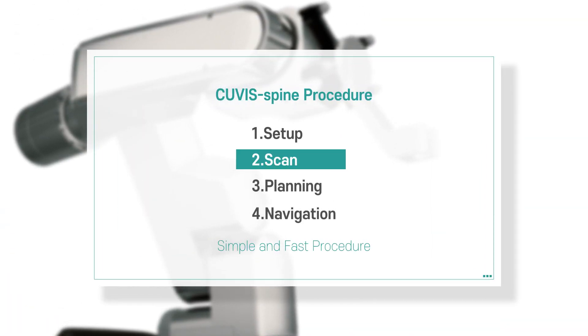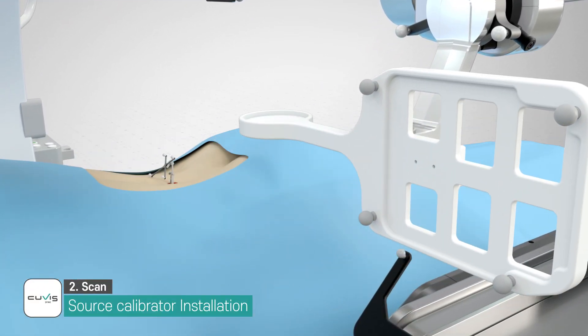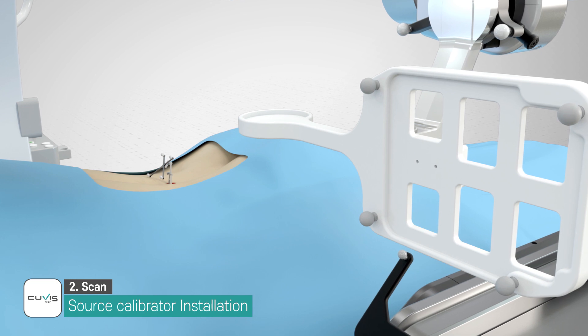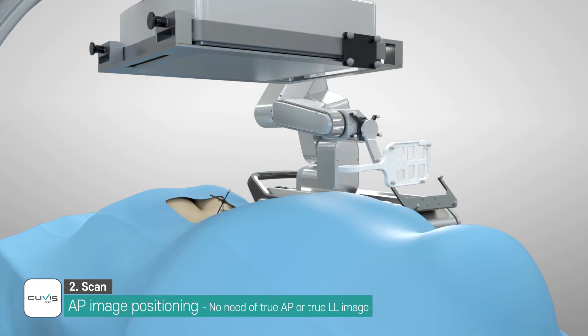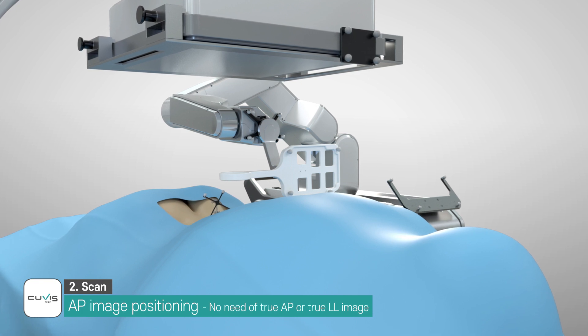Step 2: Scan. The source calibrator is attached to the end effector considering the C-Arm scan direction. The source calibrator is moved to the C-Arm scan area by the hand guide function.